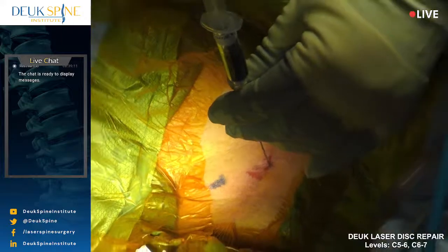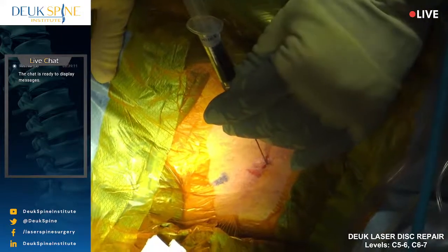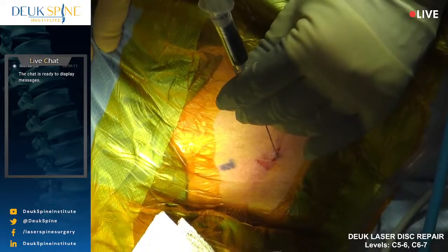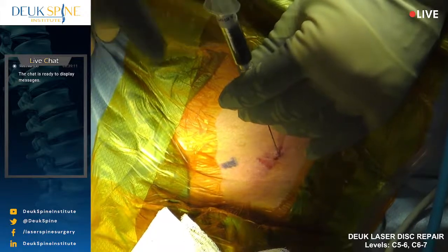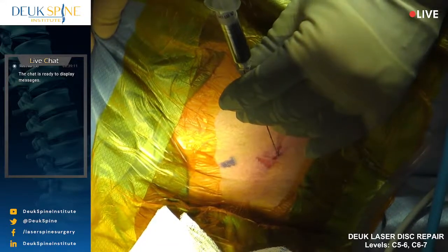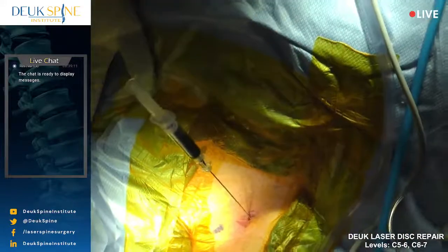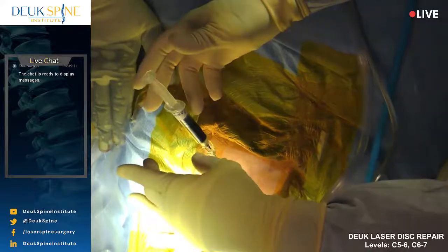We just did a discogram. I've injected some dye. I want to take a look at the internal architecture of the disc. I'm looking for abnormalities. I need a little more. You know what, Luis? I might be able to do it. Let me hold. Let me do it. Shot. There we go. That looks good.